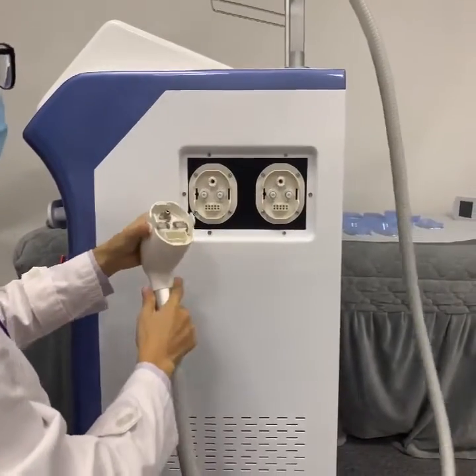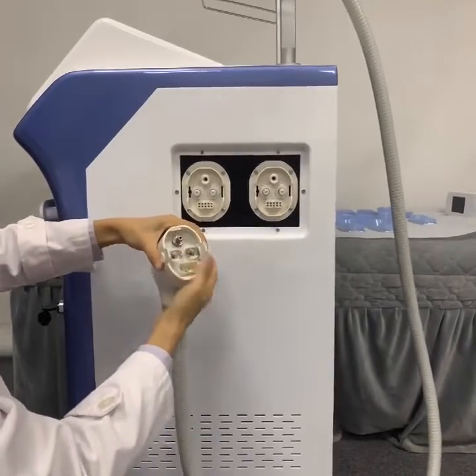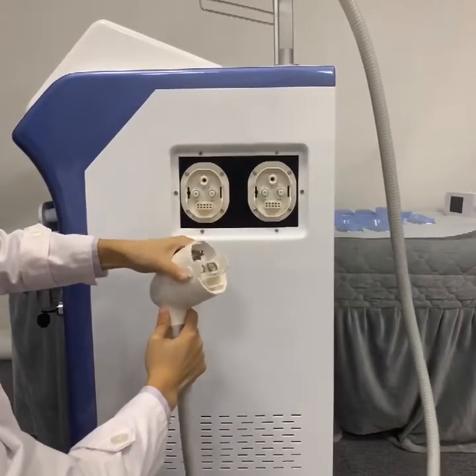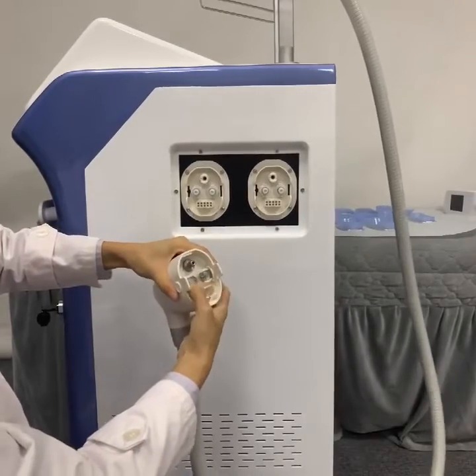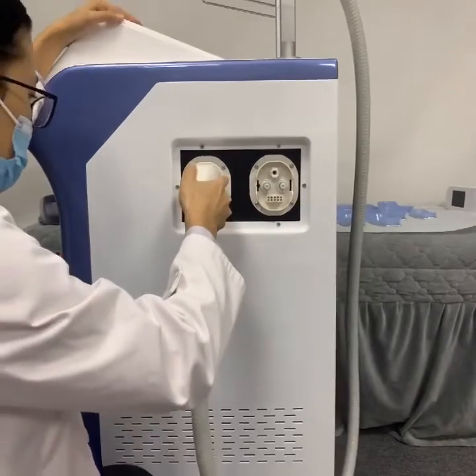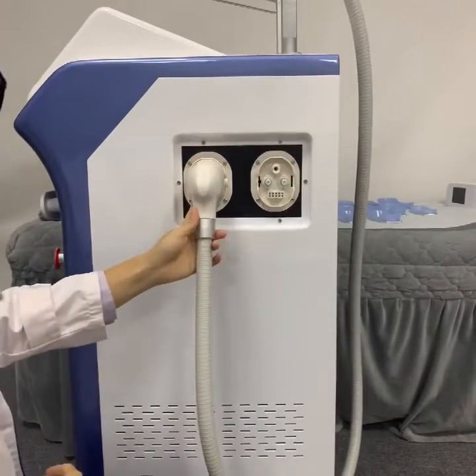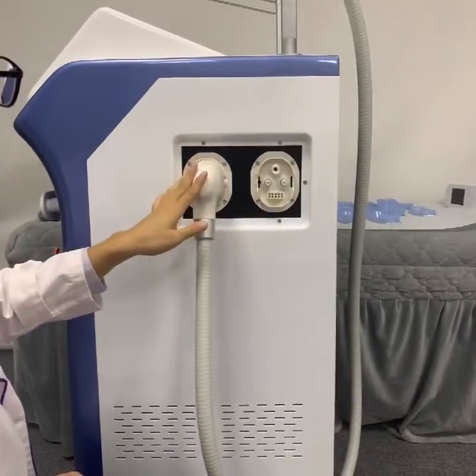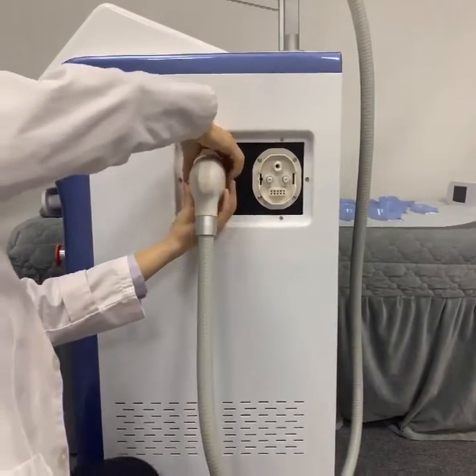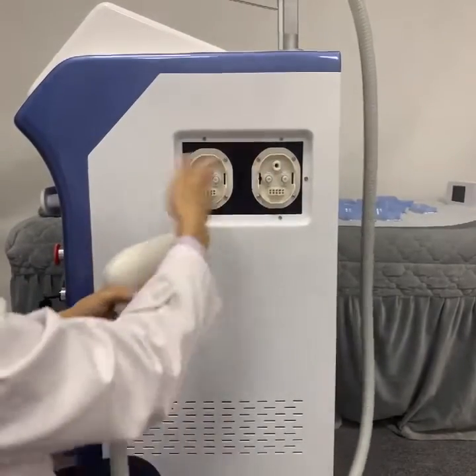The next step, we will install the working handle. You can see there are two tips in this working handle. We have to press the white button first and make sure these two tips are up. Then match the hole, pull, and push — you will hear a sound when it is finished. To remove the working handle, the same operation: press the white button and pull out.